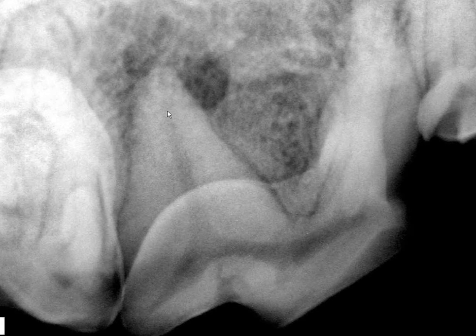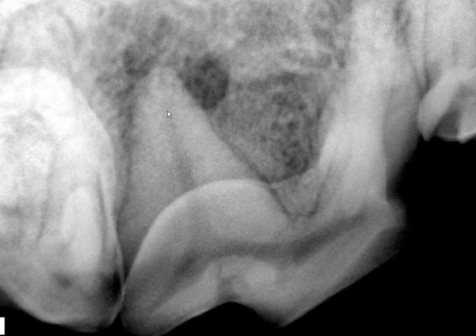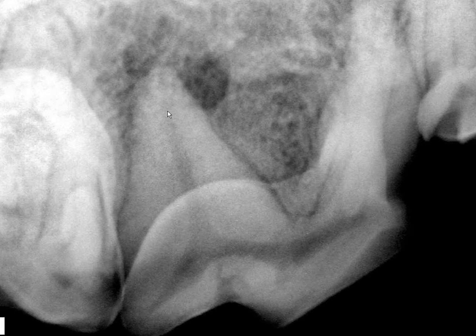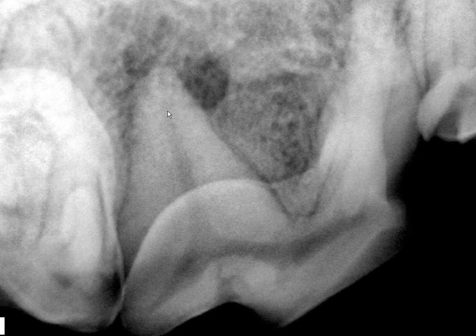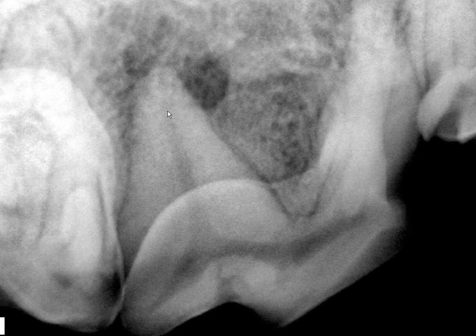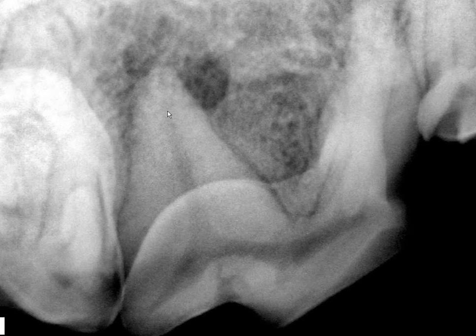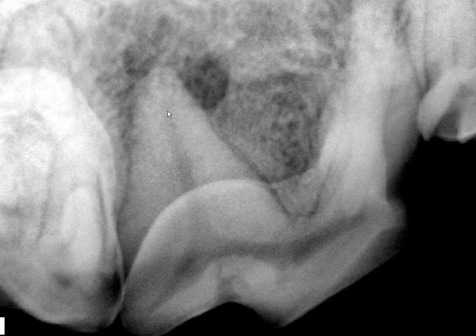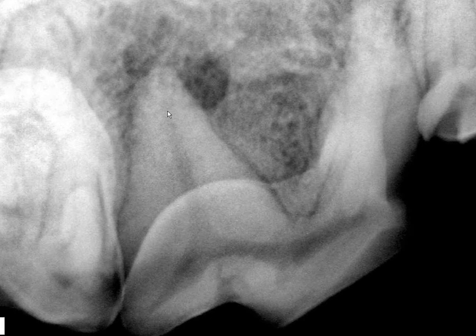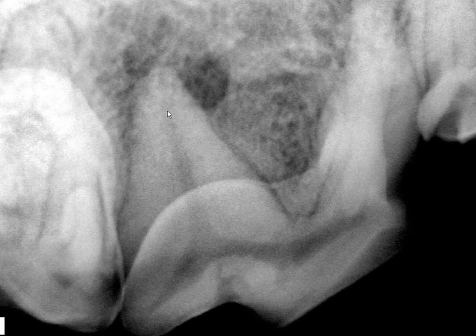And then we start to put it all together. This is a tooth root abscess, or an acute periapical infection, that's resulted from endodontic disease. We treat this tooth and the dog finally gets resolution.